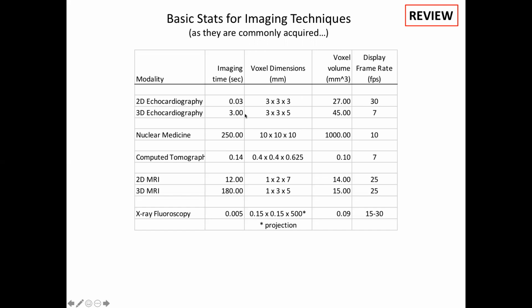You can imagine doing a 3D ultrasound image. If I can get 100 frames a second in a 2D image, then what I should do is get 10 frames a second in 10 different slices and sweep those slices back and forth. And now I have a 3D image, right, at 10 frames a second. So that's essentially how 3D ultrasound is done. You just raster through two-dimensional planes in some order, right?